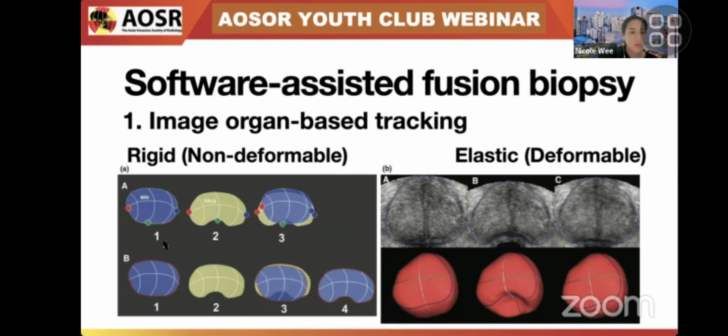So you can see on the image on the left, where my cursor is pointing, that 3 points have been placed on the MRI image in image A1, and another 3 points have been placed on the TRUS image in image A2. And when you superimpose both images on one another, differences in the prostate shape and deformation do not allow for an accurate prostate overlay after rigid registration is applied.